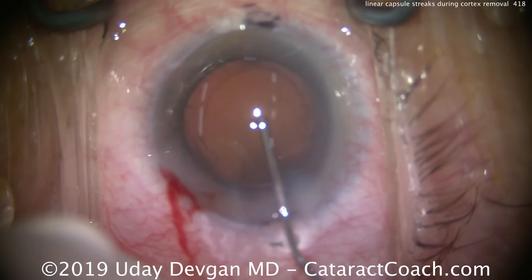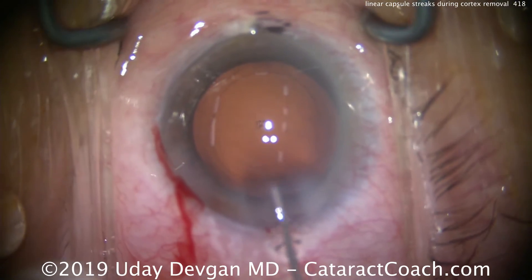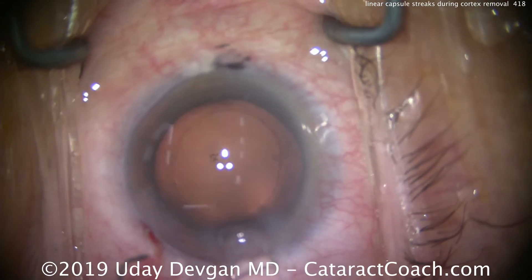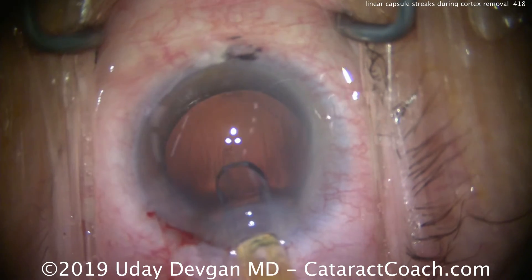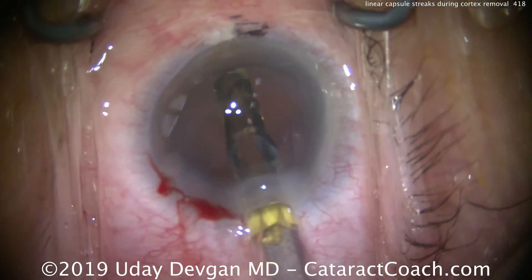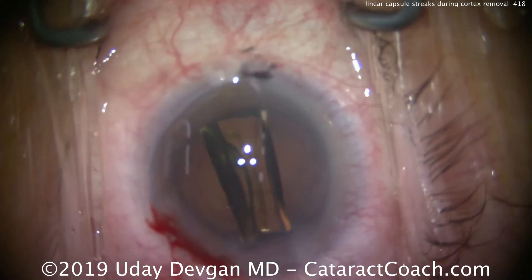Filling up the capsule bag with cohesive viscoelastic. We'll put the IOL in the bag — and that's an important step to show you the size of the rhexis, show you that the lens stays well-centered, and show you that we can put the lens in the bag totally intact. We'll fixate the eye and slowly deliver the lens, going in nice and easy, right into the capsule bag, and we'll let that unfold.